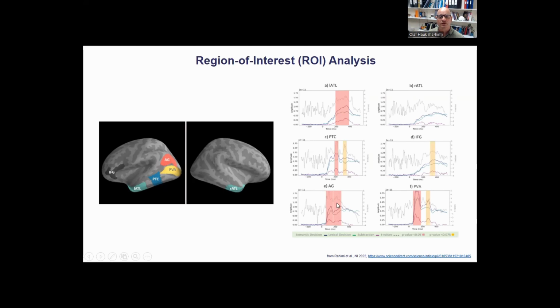This is also something interesting here. So you see this effect here. These two clusters are separated by just a small gap where there was a non-significant effect. I mean, this happens, because there are some samples here that did not produce a t-value above the threshold. That means these were not assigned to any cluster. That means you actually get these two clusters, and you have to decide now whether they are actually two separate clusters or whether it's just by chance that there were a few samples that were not significant. So you would maybe have to go back to your data and check whether the topography changes over time.